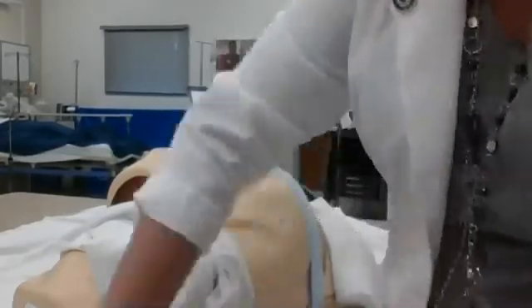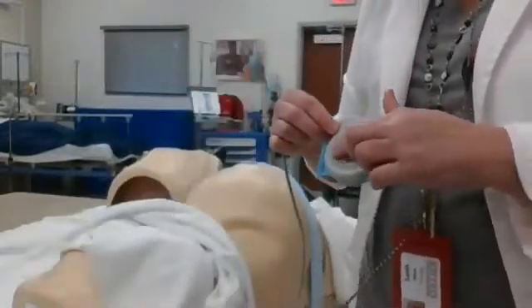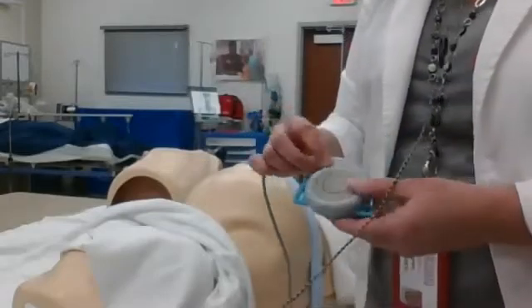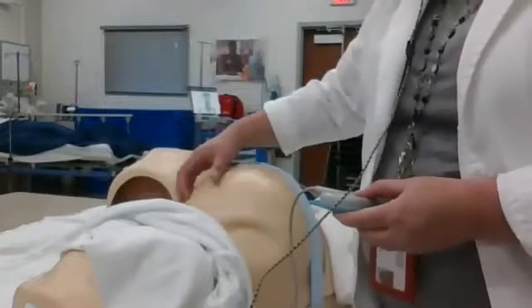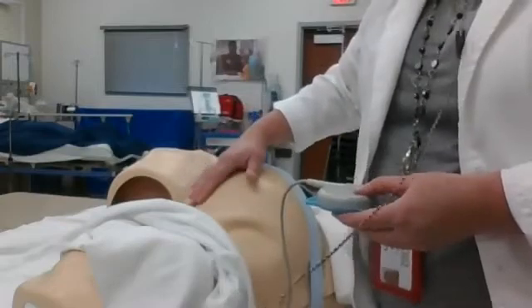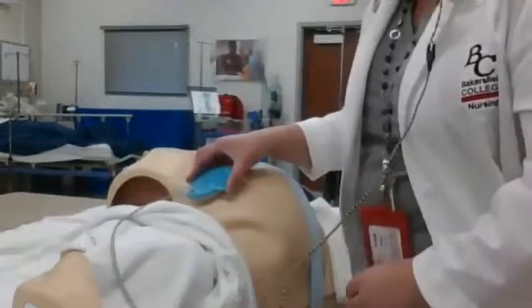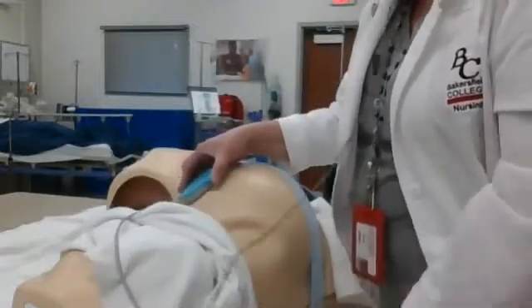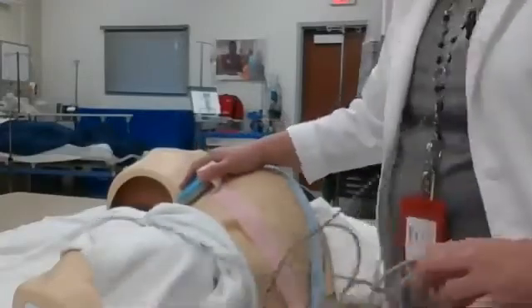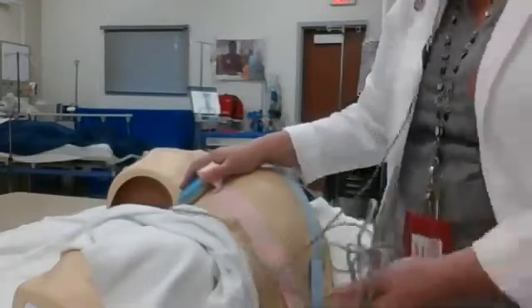You also have this monitor, which is called an external monitor — a tocometer. This is going to pick up contractions. You can see it has a button here. It is literally just sitting on top of the belly, the fundus, and it picks up movement. It does not tell us how strong contractions are, just picks up movement. I would place this at the hard area and again use my strap to hold it down. Both of these are going to plug into the electronic fetal monitor, and in another lecture we will be discussing what we're looking for.